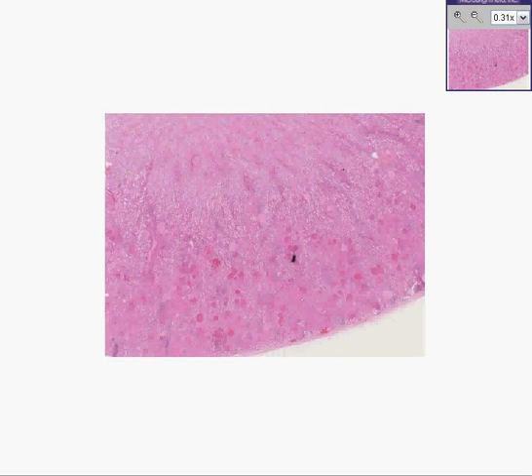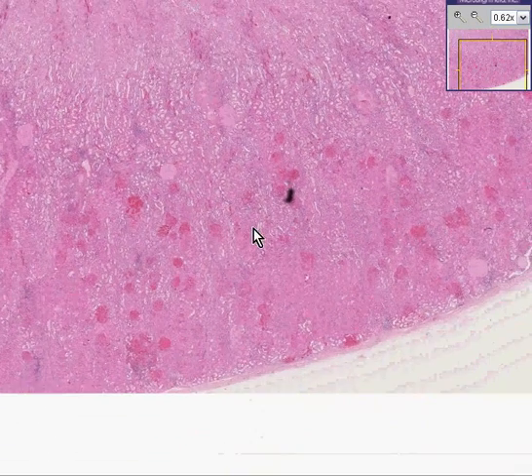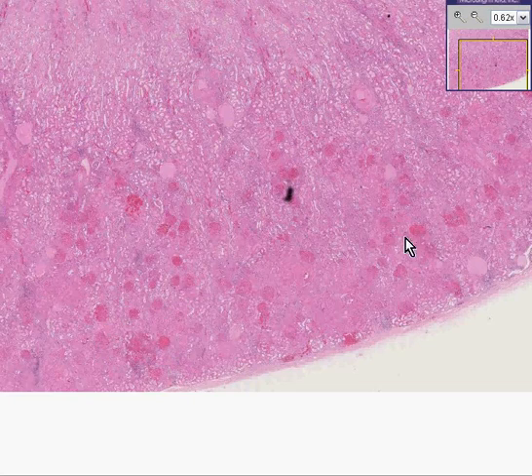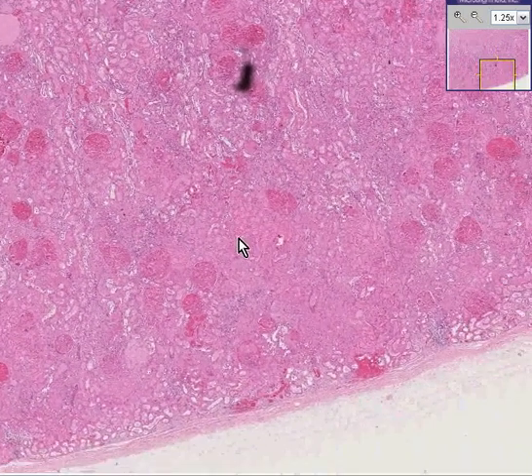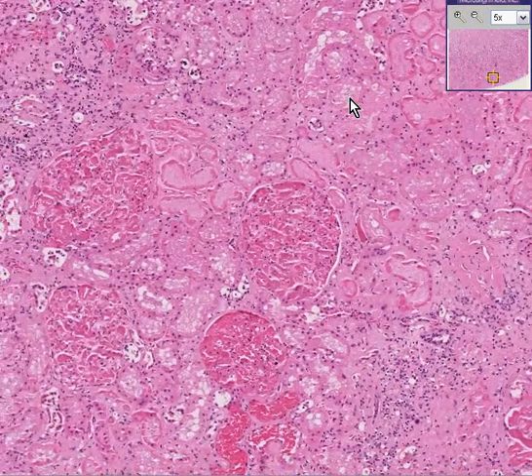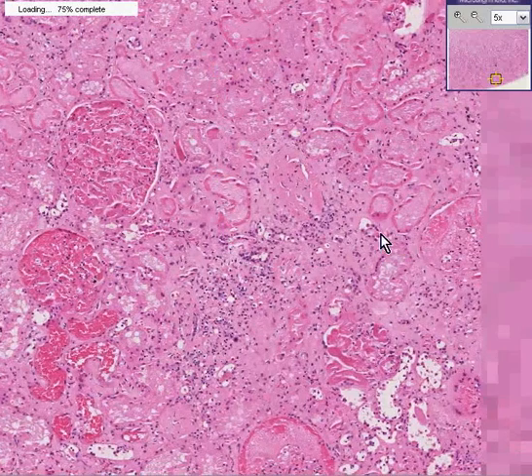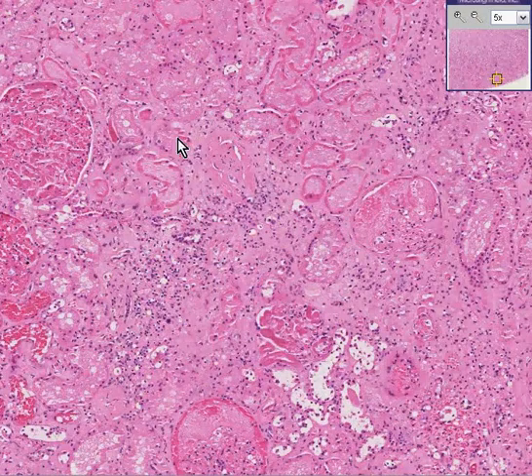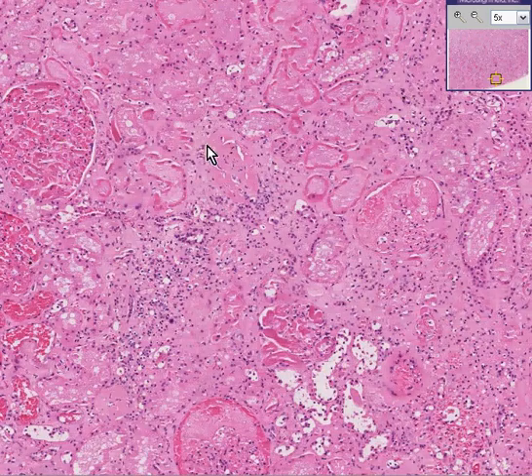Here is a case called Disseminated Intravascular Coagulation Microthrombi Microinfarcts Kidney. We can recognize that we have a kidney here. You can also notice that the glomeruli seem to be standing out quite a bit, in that they seem to be a lot redder than usual. You can also notice that the cortex looks like in many areas, especially in the tubules, it has lost its delineation of cellular detail, like you see in infarcts. Notice how these glomeruli seem to be quite red.